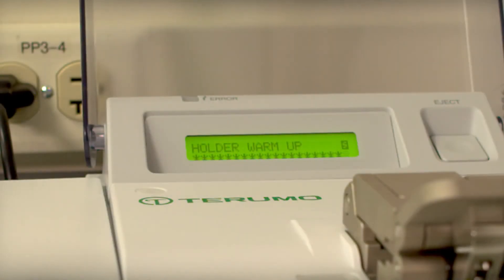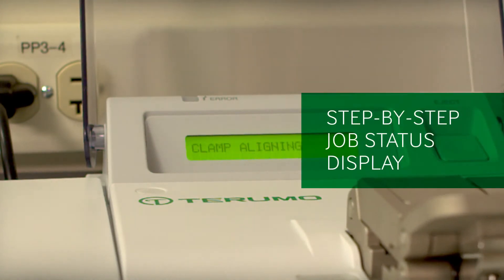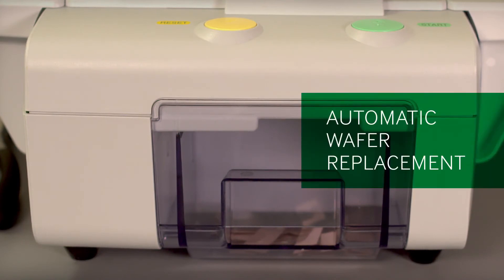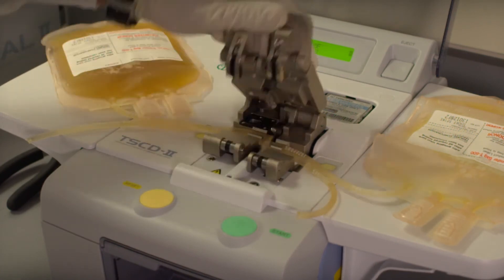Throughout each weld, operators are kept informed with an LCD display that communicates the status of the process. After the welding process is complete, the wafer that enables these strong welds is automatically replaced with another wafer. This is an added operator convenience and minimizes jams.